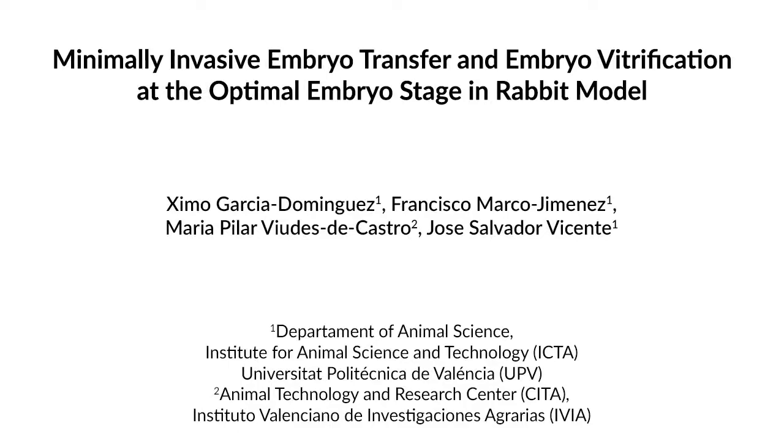The main goal of this experiment is to describe a laparoscopic embryo transfer procedure in rabbit as a model. The main advantage of this technique is that it is worthwhile to transfer embryos using an easy, minimally invasive technique. Furthermore, the effective embryo cryopreservation protocol described here allows long-term storage of rabbit embryos, providing time-flexible logistical capacities and the ability to transport the sample.